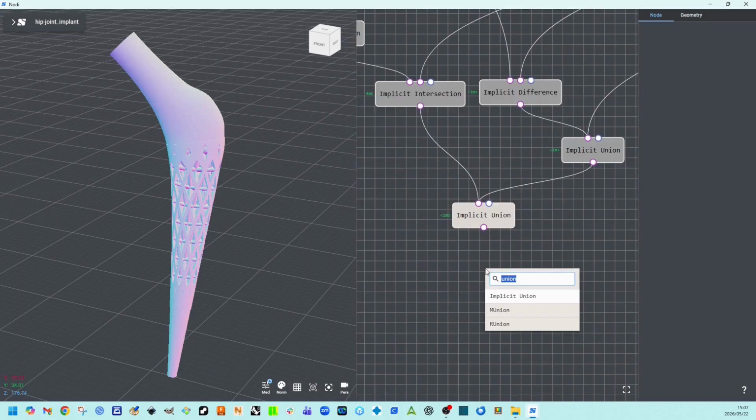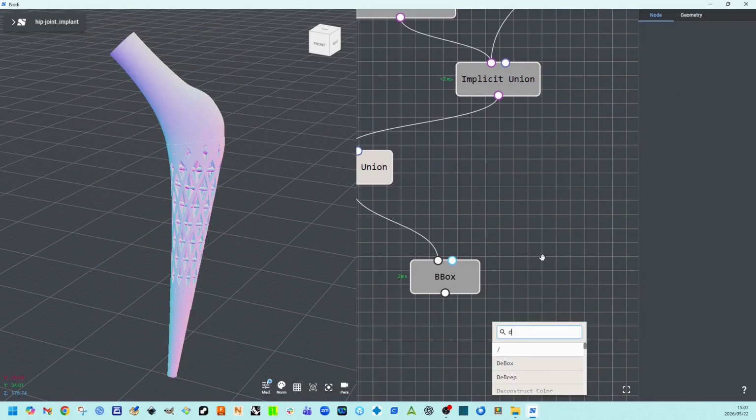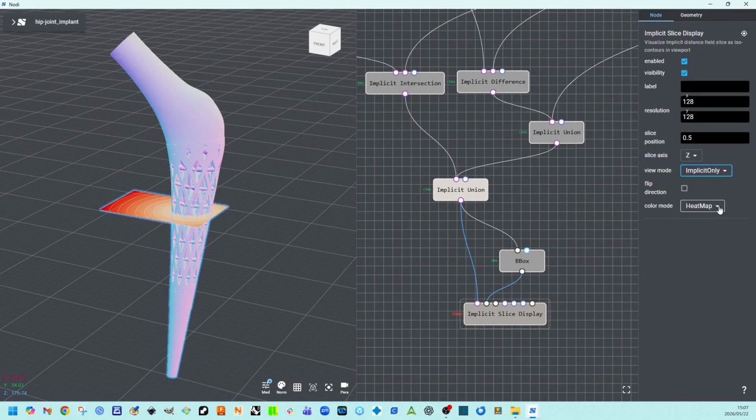To inspect the result, we add a BBox and an implicit slice display, driven by a number slider. The heat map reveals the signed distance field at any cross-section.